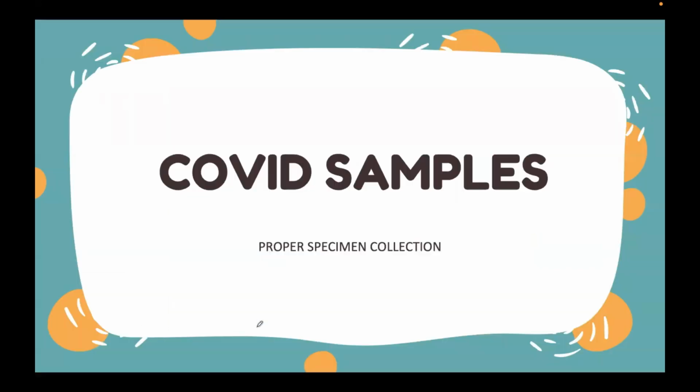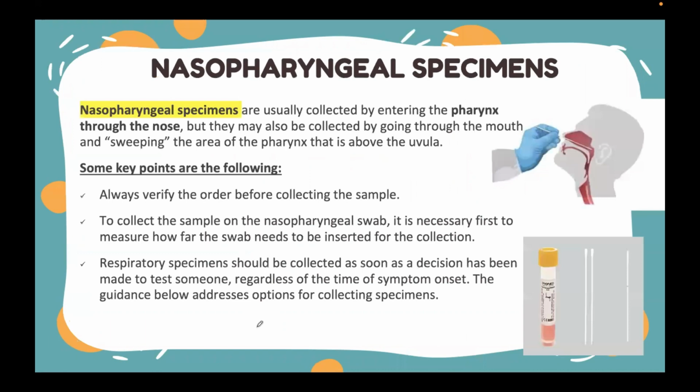So next, proceed na po tayo in the proper specimen collection of your COVID samples. So na-discuss na natin yung ating proper pipetting techniques. So it's all up to you kapag na-apply na natin siya sa ating face-to-face setup. But first, at least na-discuss na natin yung kanyang principle. So next, let us proceed to your proper specimen collection for your COVID samples.